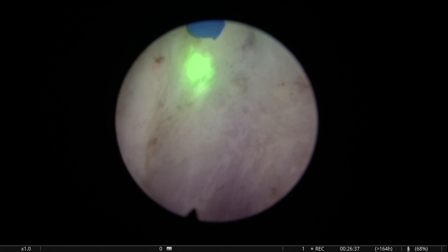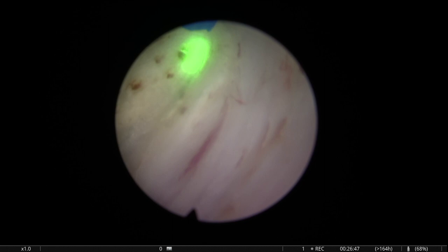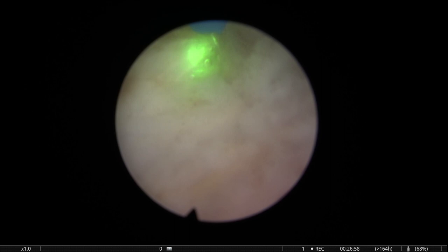So here, you see how careful and how nicely you can decide what plane to follow. Sometimes you have a very nice line of attack that tells you exactly where to go, and the feedback you get from the tissue is good. You know that you're in the right place in the interface. There's no yellow tissue left behind, and then it's a little bit easier to progress.